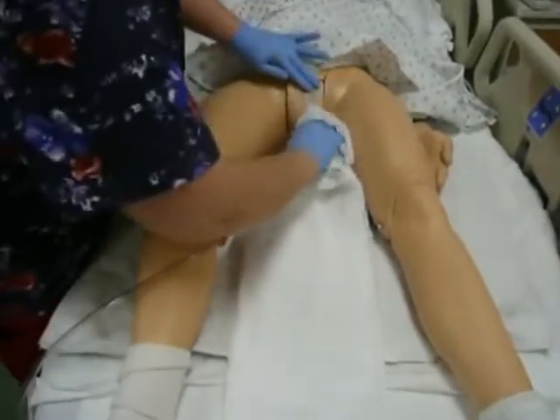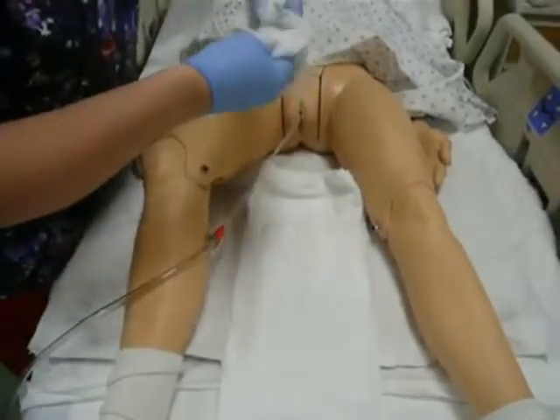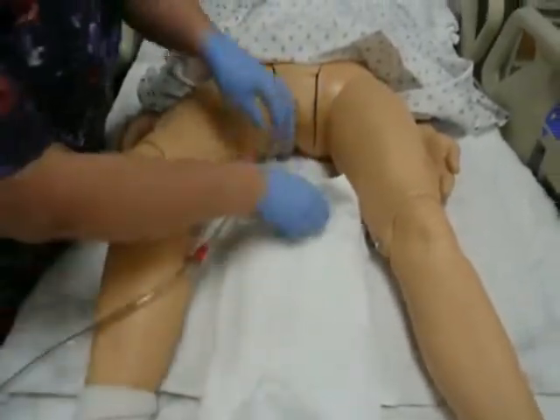I'm going to roll it out and make sure that I do good peri care for her so that the betadine that I had on her is off. And you'll notice I'm switching the sides of my washcloth and then cleansing off the catheter.